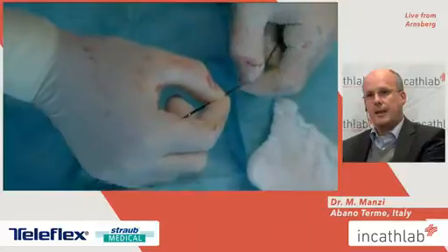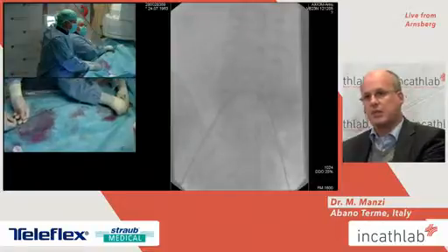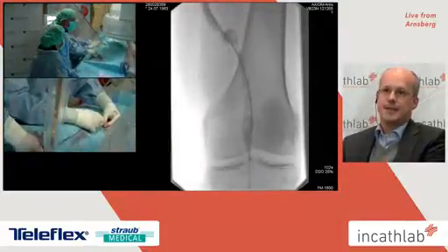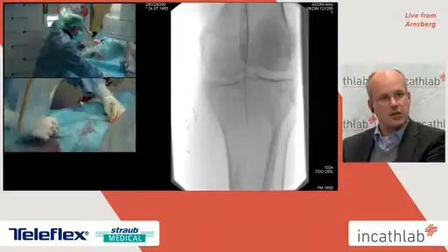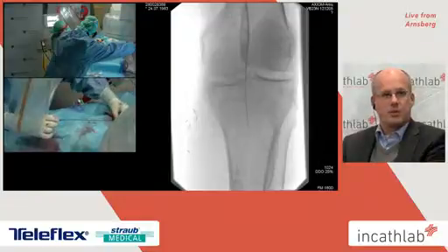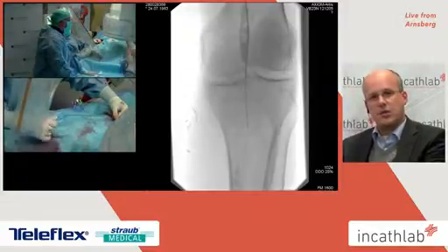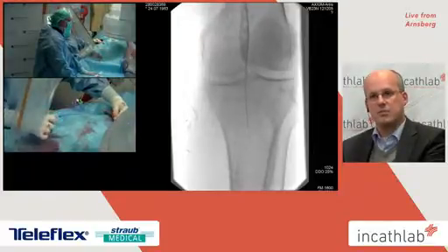Yeah, I think you're totally right that we really had a problem with the crossover maneuver in this particular patient. The reason we decided to go crossover is that we did not have a stump of the bypass origin. So, of course, as a trick, we could have used ultrasound guided puncture directly of the occluded bypass, maybe for an antegrade access, or a high common femoral artery access, ultrasound guided. Afterwards, I would say the crossover maneuver in this particular case was quite difficult, and of course antegrade access is always much easier.